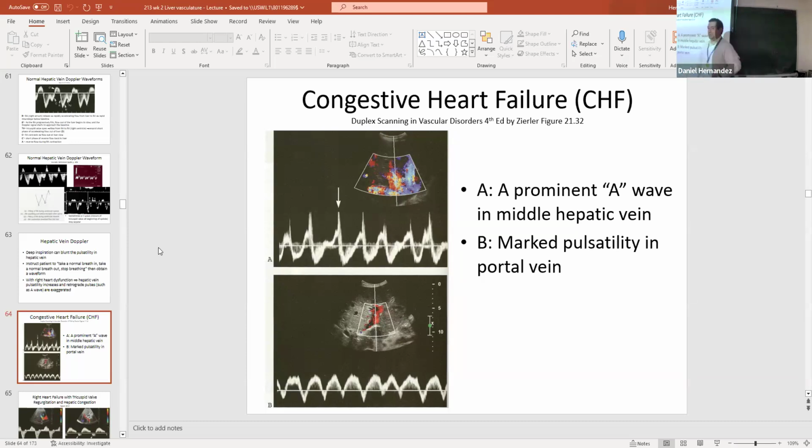But sonographically, you're looking at that liver and you're like, that liver doesn't look bad at all. I can see all the vessels, there's no increased echogenicity. It doesn't look fatty. It's normal size. Their liver functions are normal. Like, what's going on here? But this is just a result of their having underlying cardiac issues.